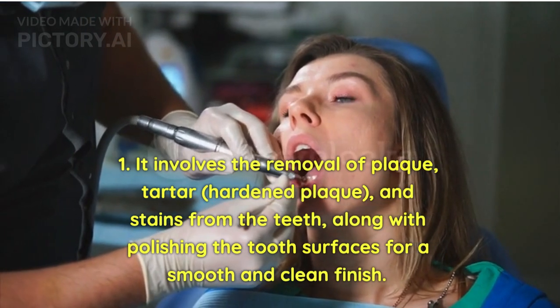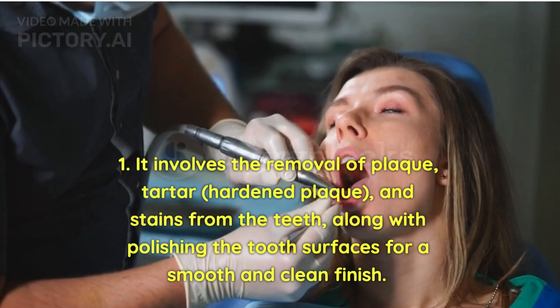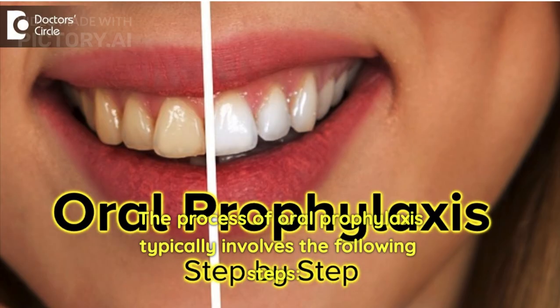It involves the removal of plaque, tartar (hardened plaque), and stains from the teeth, along with polishing the tooth surfaces for a smooth and clean finish. The process of oral prophylaxis typically involves the following steps.